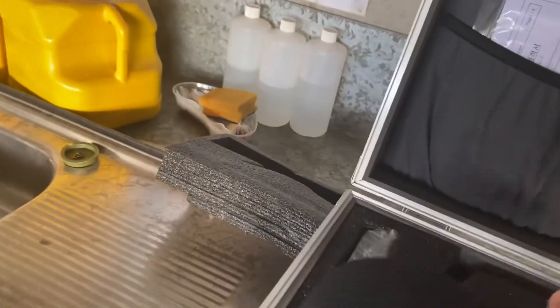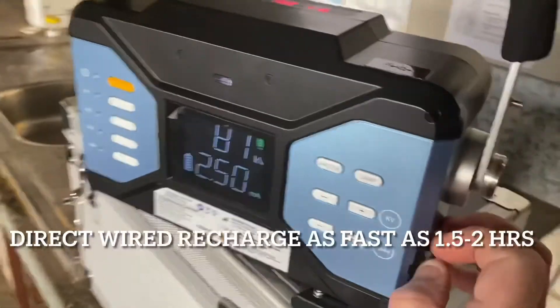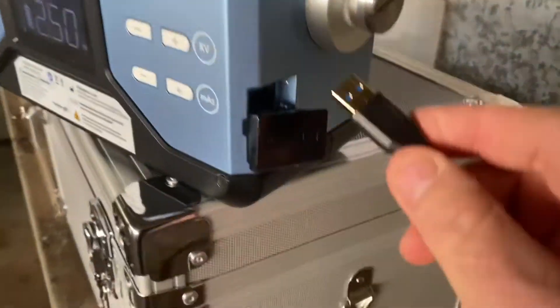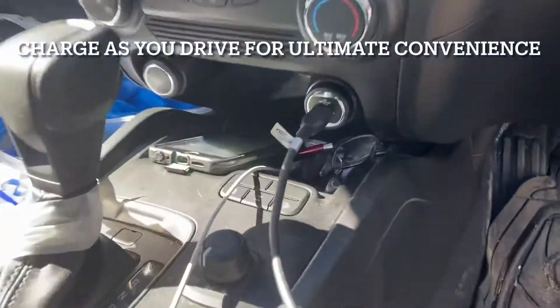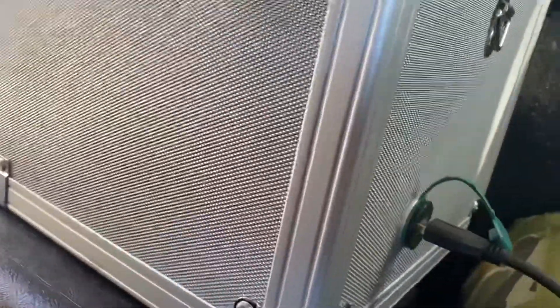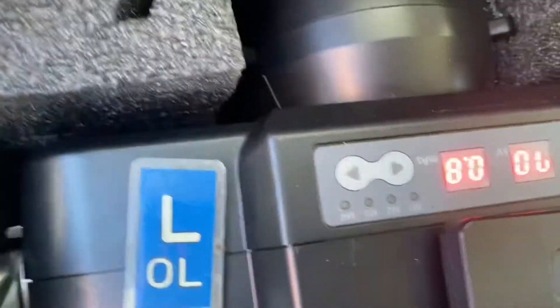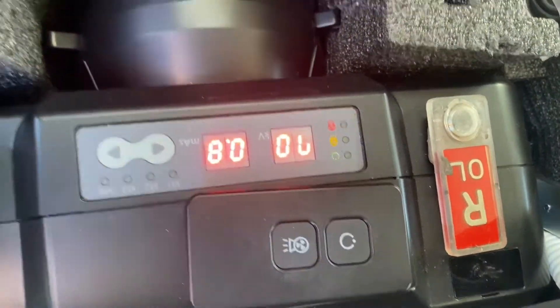You can also charge it directly into the machine by plugging in here. One of the great features of this POSCOM X-ray machine is that it will charge while you're driving, as it's plugged into the cigarette lighter. You just place it in the case like that and it will tell you that it's charging.